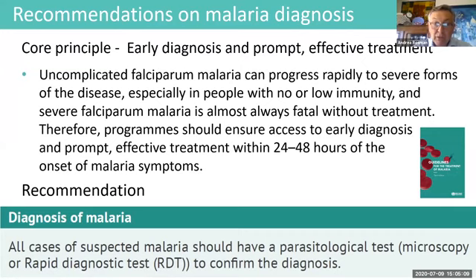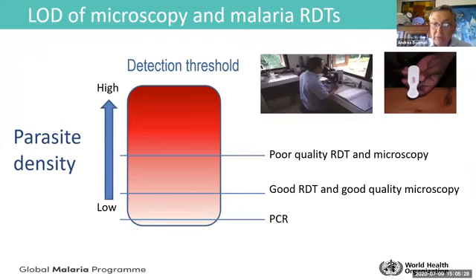This is maybe something we all know, is basically everybody should get a test before being treated, and early diagnosis should be done with either microscopy or a malaria rapid diagnostic test. And when we compare the two, these are very equivalent in terms of diagnostic performance.